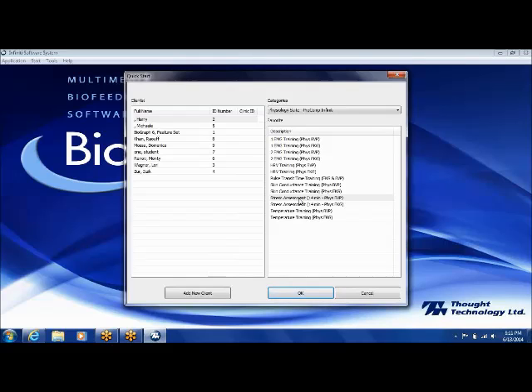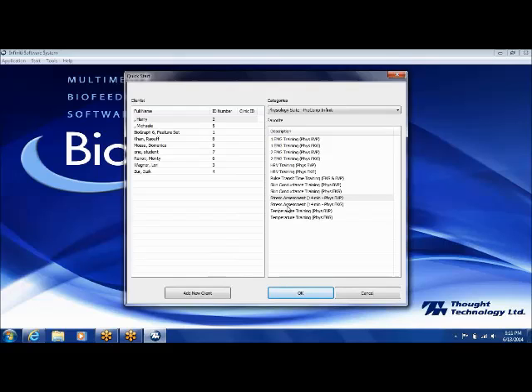The stress assessment is a different type of session and would be considered a script session. A script session is where things are more automated. This says stress assessment 14-minute physiology suite BDP — so it's a 14-minute recording. The screens are all chosen for you, there are instructions that come up, the timing is all set, and the statistics you see at the end are all preset. It's called a script because it's already written and you're just following it. Temperature training is another open display session.